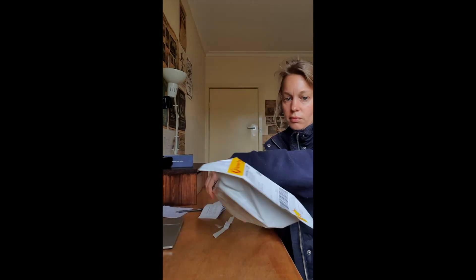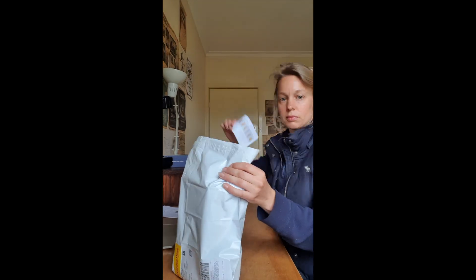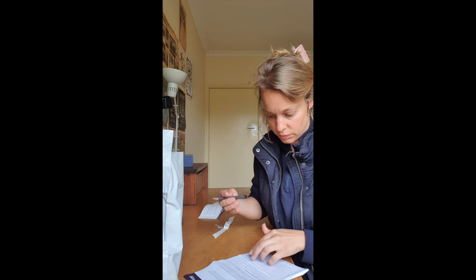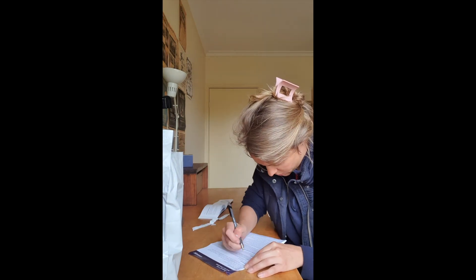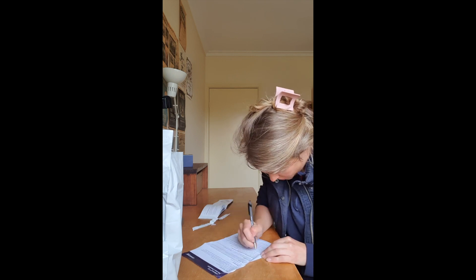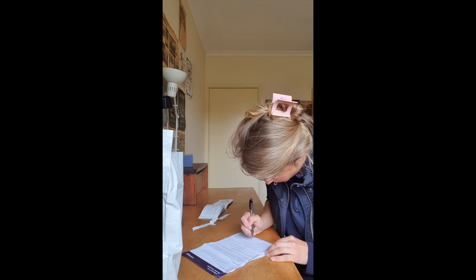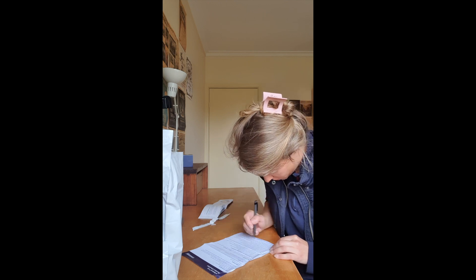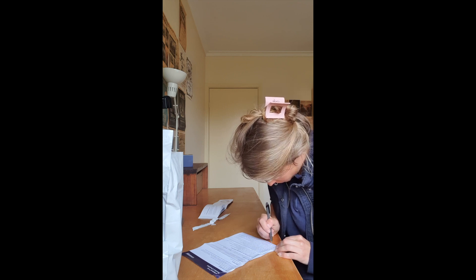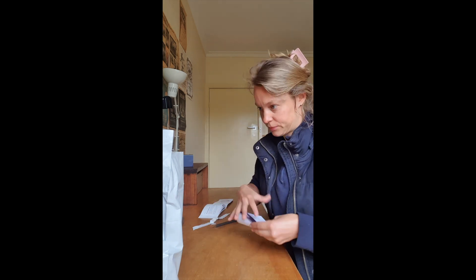Pop that into your parcel, then grab the Bristol stool chart, pop that in, get your checklist out, go through each item, and just double-check that you followed all the instructions. Quickly complete that, then pop it in the envelope, and you're basically ready to take that to the post office. Well done — it's a little bit of a tedious process, but you've got this far and it'll be great to see your results.